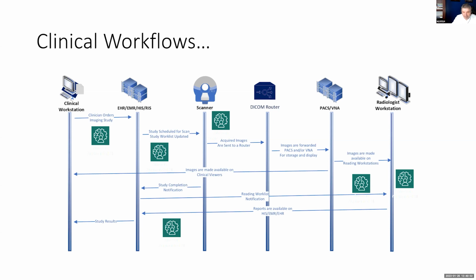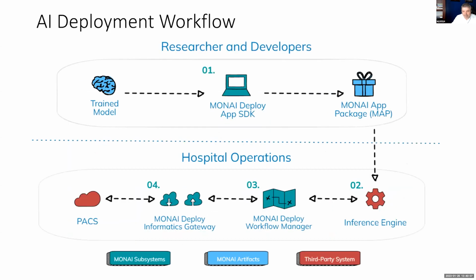So with that in mind, I'm going to move to next. What we are talking about within the current scope, as MONAI is always evolving, we're adding more and more items that we are working on.